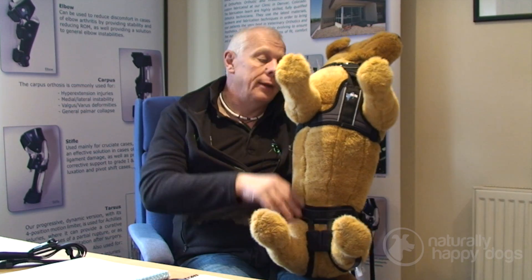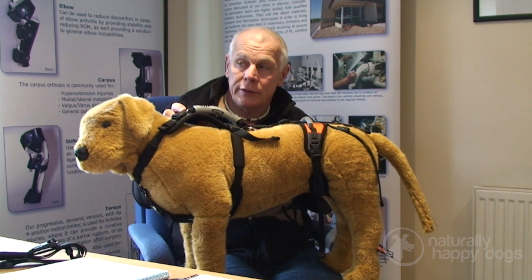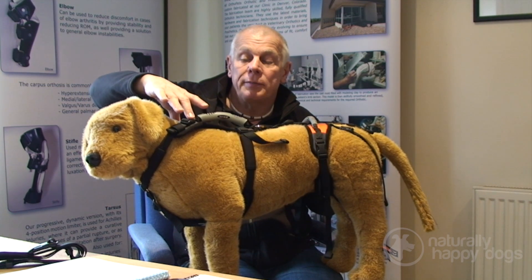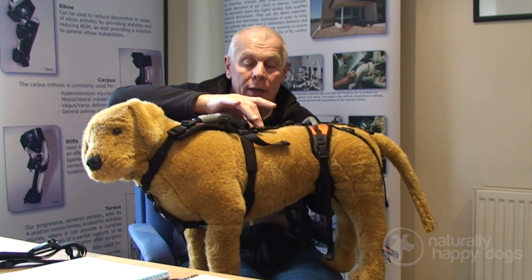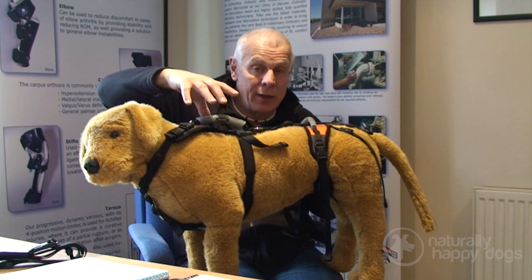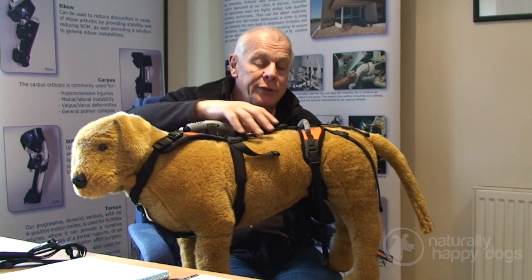It's available for all dogs up to about 70 to 75 kilos in a range of sizes, and it's multi-adjustable. On our website at orthopets.co.uk there are videos showing you how to tell whether your male dog needs a U-band or a conventional harness, and how to fit it both with the dog standing up and lying down — because with a lot of these dogs they can't get up without the harness, so it's essential that you can fit it while the dog is lying down.